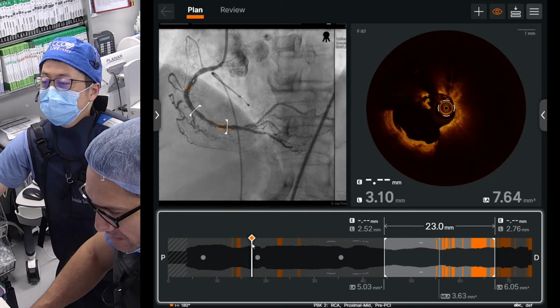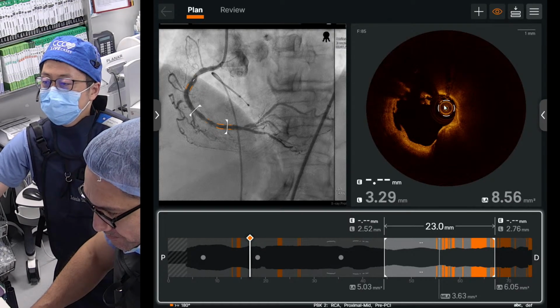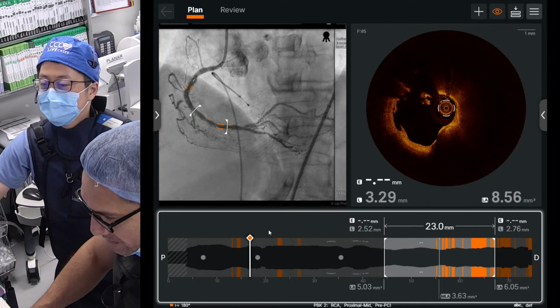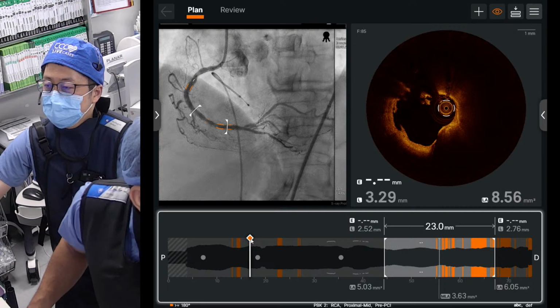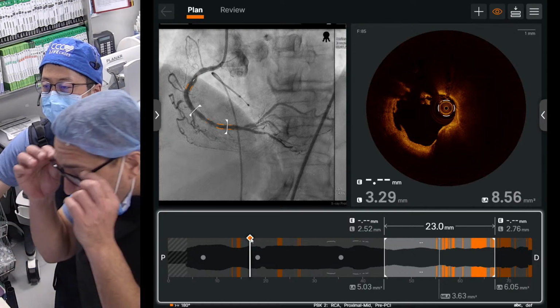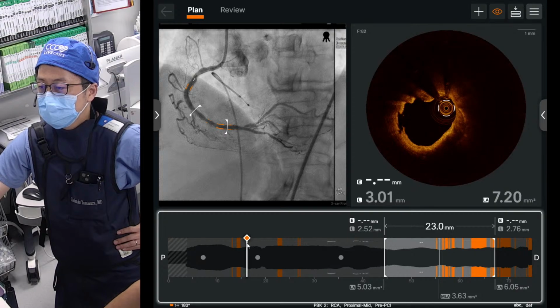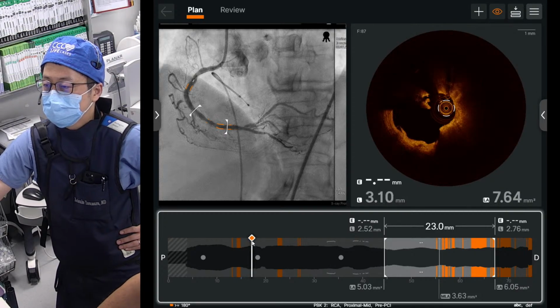Yeah, here. This was our tightest spot previously. Now 3 o'clock is shaved by the rotor, and the other half is with some dissection. The other half, we think it's dissection because it's non-calcified fibrous tissue. Correct. So between calcium and fibers. Yeah, we see a lot of these kinds of fractures.